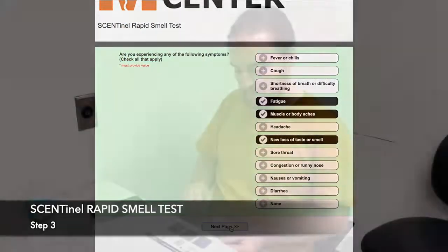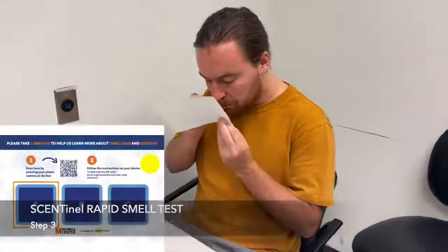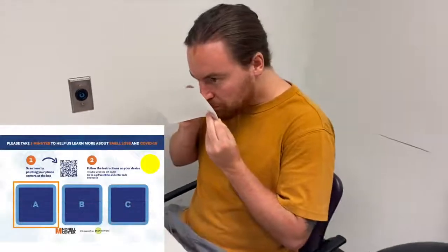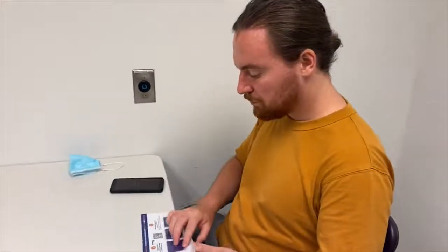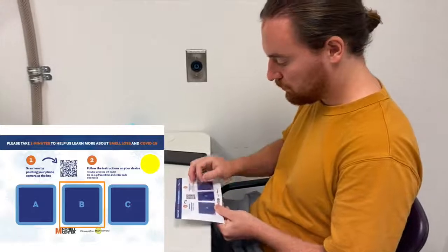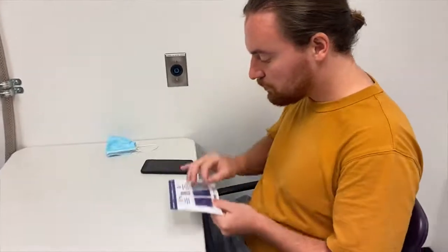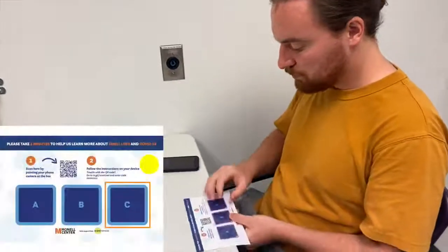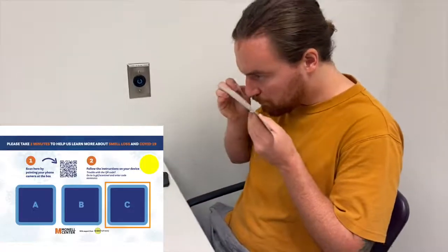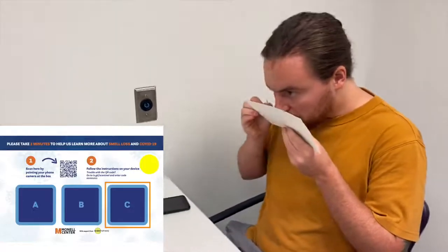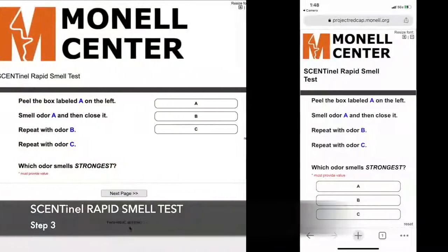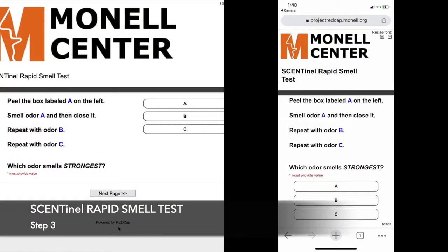Going back to the card, one at a time, lift the corner of each sticker, smell, then move on until you've lifted and smelled from all three stickers. Please re-smell from the stickers as often as you'd like, and when you've smelled them to your satisfaction, if you detected an odor, make a rating on the website as to which odor is strongest, and if you don't know, please guess.